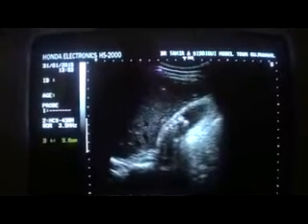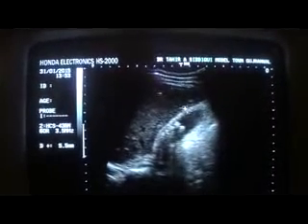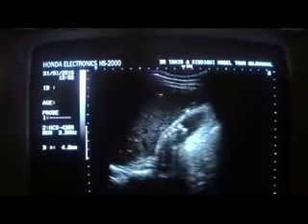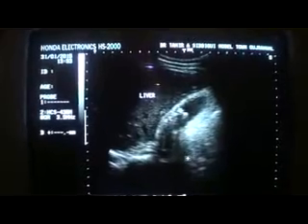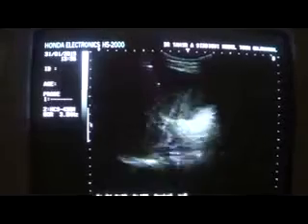This measures 3.6 mm, and the wall measures 5.5, rather 4.8, and this is a thick wall, keeping in view that he is on an overnight fast. This is the liver, and all these tiny echogenic particles are giving posterior shadow. This is the shadow. These shadows. No liver parenchymal disease is seen. Now this is the ultrasound in supine posture.